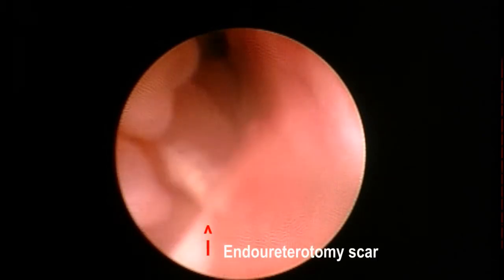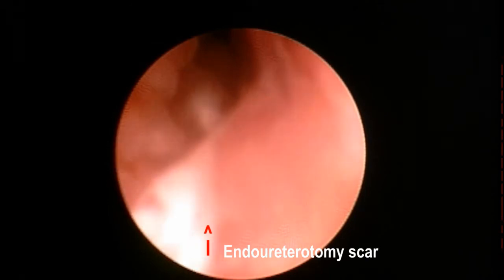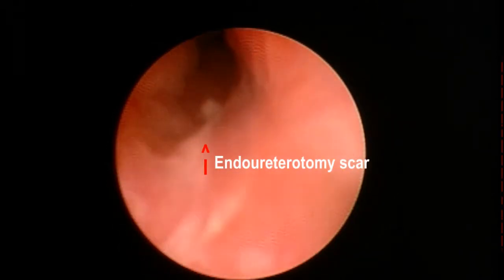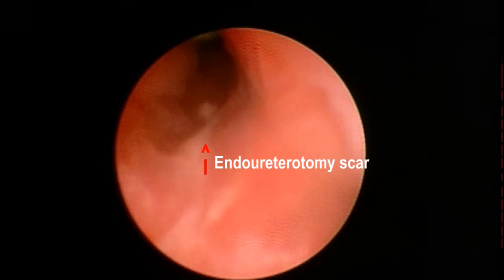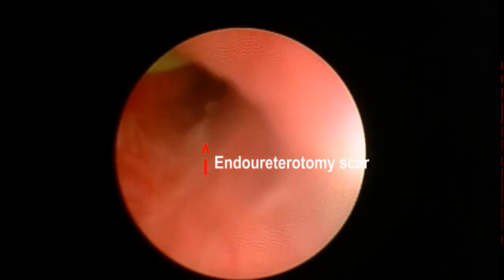Slow motion showing the ancient location of the stricture with the scar of the endo-ureterotomy. Above the treated area, there is the ureteral bifidity.